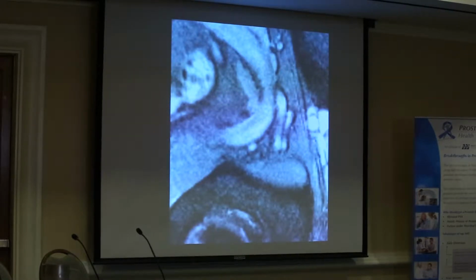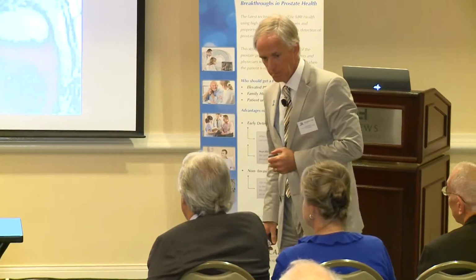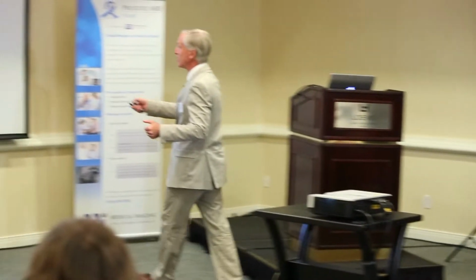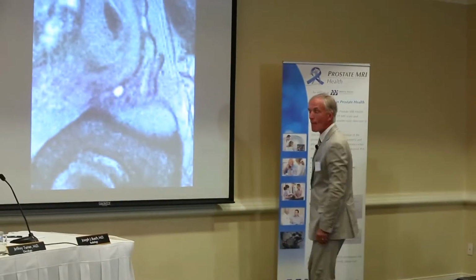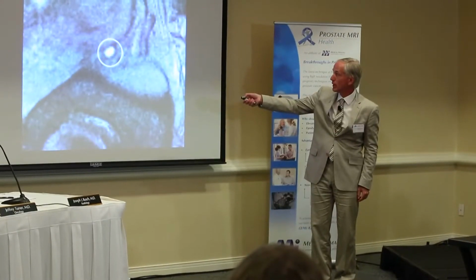Joe, you're sitting in the first row on purpose. How many positive lymph nodes do you see, and where are they? You've got 10 seconds, because on the next image you will have even less time to do that. And time is money. 9, 8, 10. Okay. Here, there, this one? Okay. And now? Okay. You missed this one. This was a normal one. This is an abnormal one.